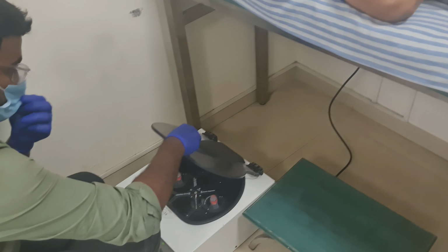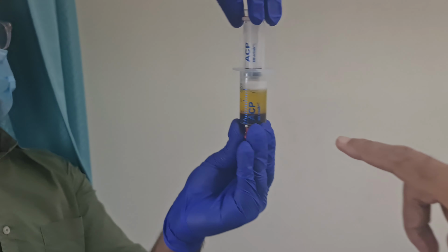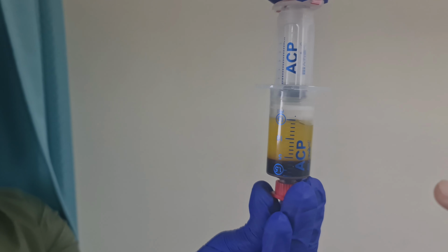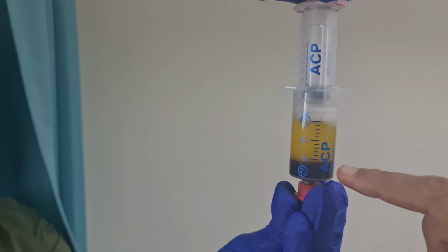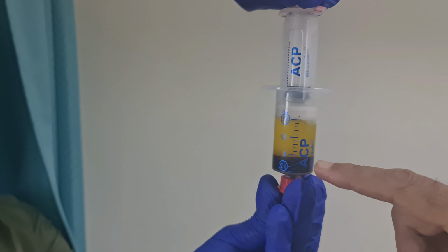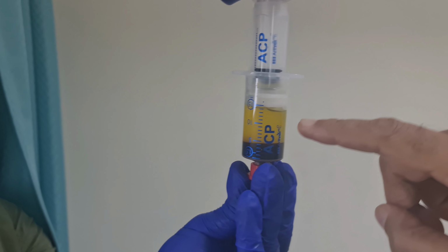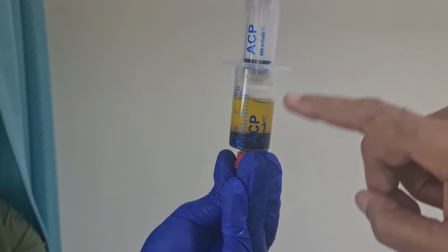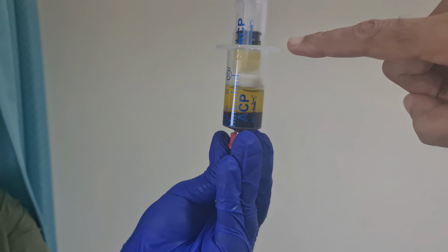Now the centrifuge is over and we are going to take out the PRP. So this is the first syringe, clear PRP. This is the portion of the blood containing the red blood cells and white blood cells. And this portion is the clear blood, supernatant fluid. This contains platelet-rich plasma. So we are going to aspirate and draw the platelet-rich plasma into the inner syringe.